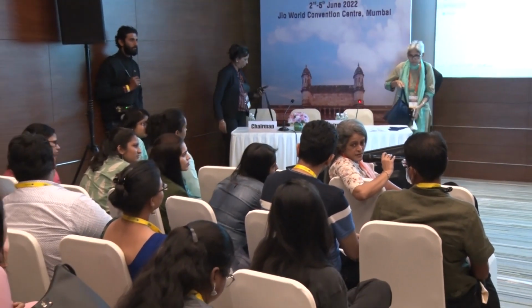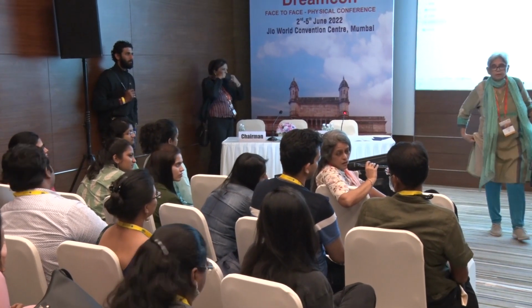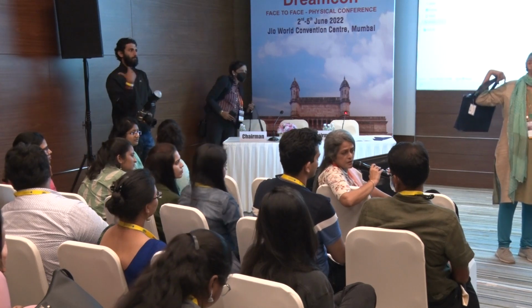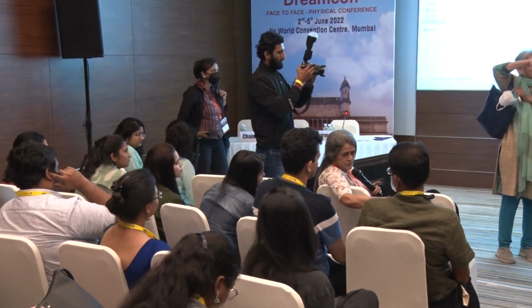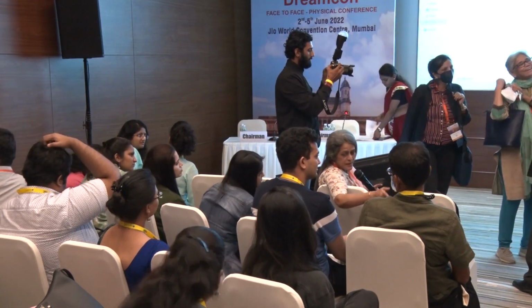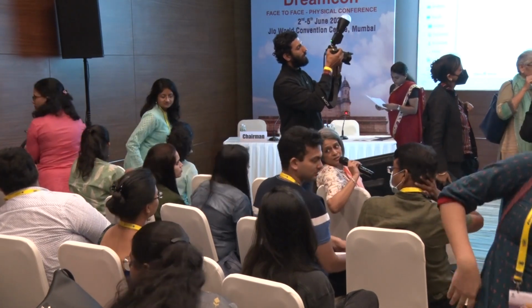What is the ideal time? SITA Standard, SITA Fast, depending on what strategy it is. Usually it takes less than 5 to 6 minutes. Again, the patient can pause. If the patient is pausing with the button on the mouse, the machine pauses, so the time stretches. So it depends on which strategy you're using.